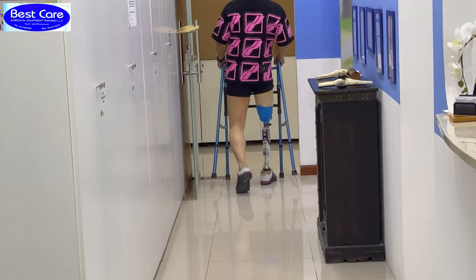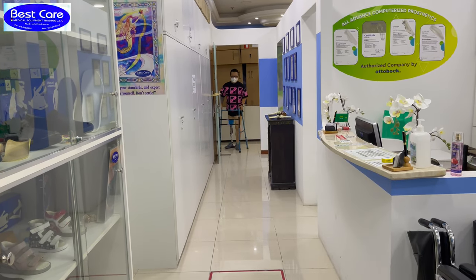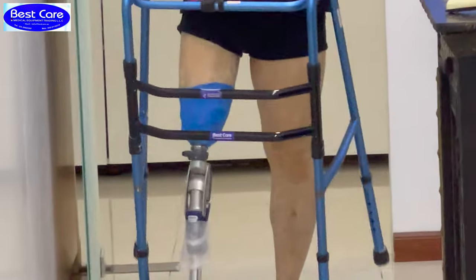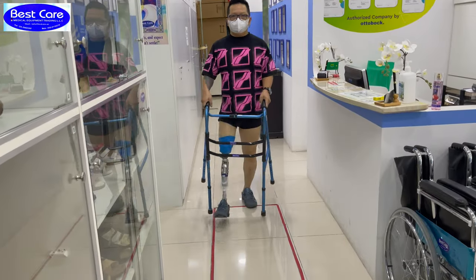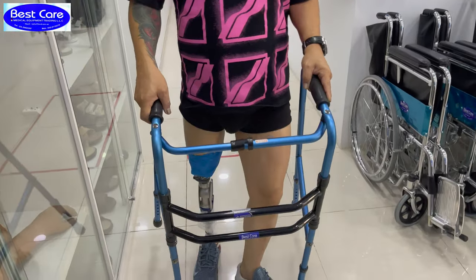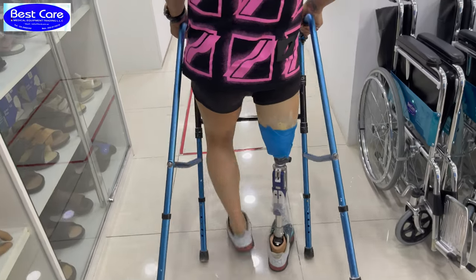And as you can see here, I will show it to you now. You can see here, it is the blue one. It's fixed with Cellacast. It's already strong for the trial, but not to give outside the clinic. You have to stay with the patient, and with the walking frame, it's much safer for the patient to walk with it.